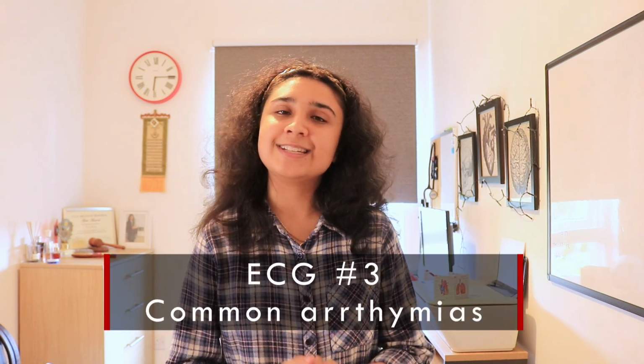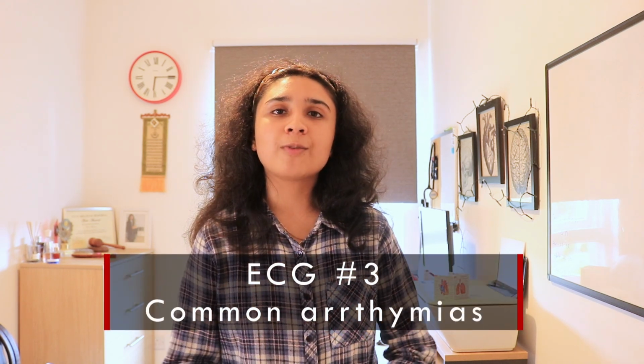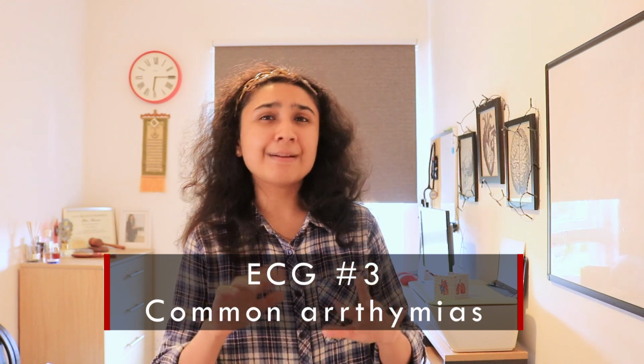Another video from HSTV, and in today's video, as you can see by the video title, this is part 3, the final part of the ECG series, where we will be going over some common arrhythmias and examinable content that's likely to come up. So if you haven't already, do go and watch parts 1 and 2, as this is really a continuation of that.